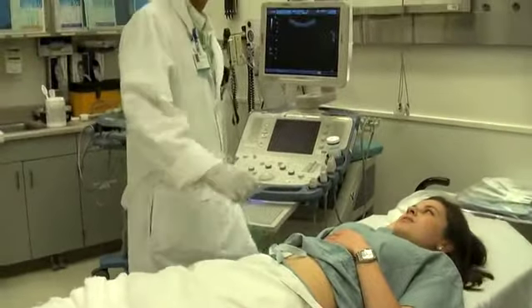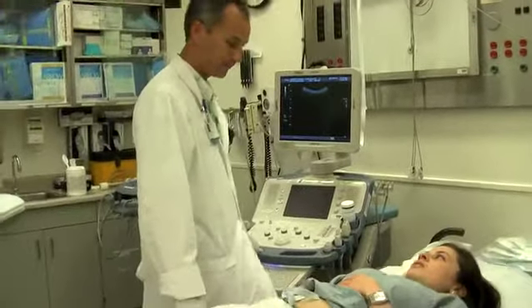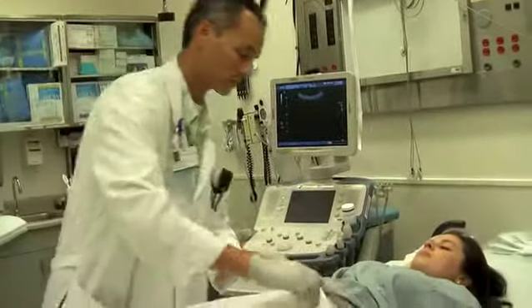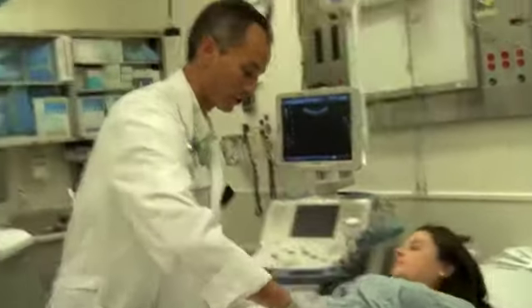If possible, you should also always try to scan from the patient's right. Good point. Thank you. Sometimes our rooms aren't set up to scan from the patient's right, but it's optimal if you're right-handed, because you can scan with your right hand and then type on the keyboard or change your depth or your gain with your left hand. I appreciate it if you can do that, although I know some of the rooms aren't perfect for that setup.